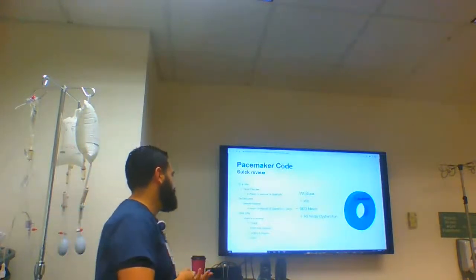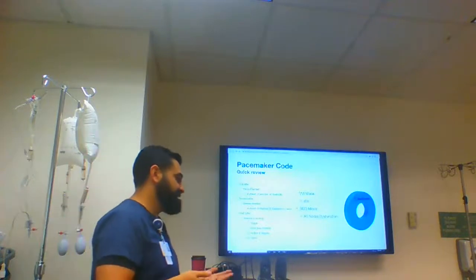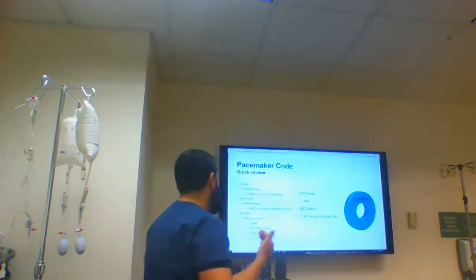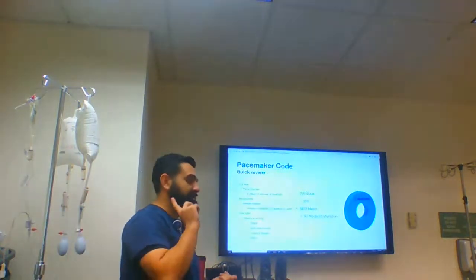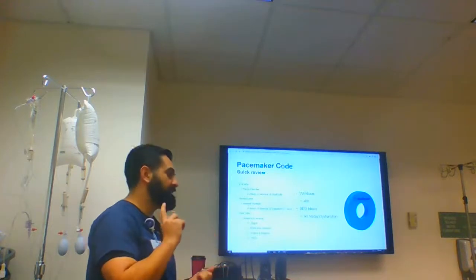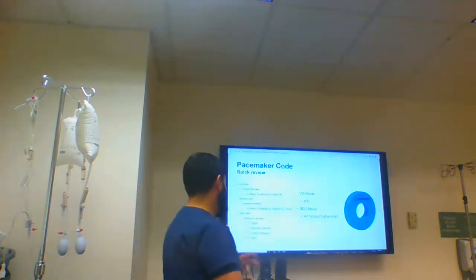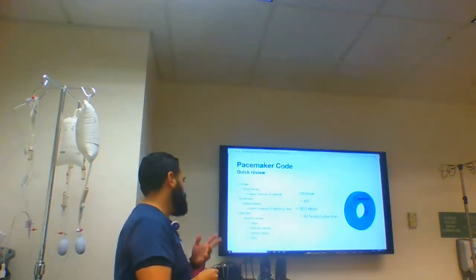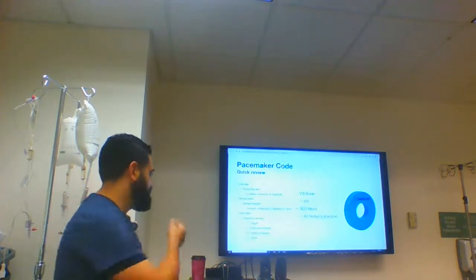And then the third letter is when the pacemaker detects your intrinsic beat, which means the patient's own beat, what is that pacemaker going to do? It's either going to trigger a pacemaker beat, or it's going to inhibit it, and when we inhibit, that's what's known as an on-demand pacer, okay? And then we can do inhibit and trigger, or we can do nothing.